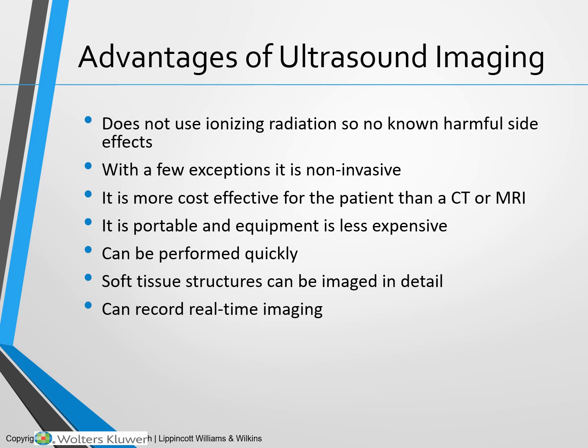Usually, I would say average ultrasound scan is about 20-25 minutes, some being more, some being less. Soft tissue structures can be imaged in detail, and we can record real-time imaging.